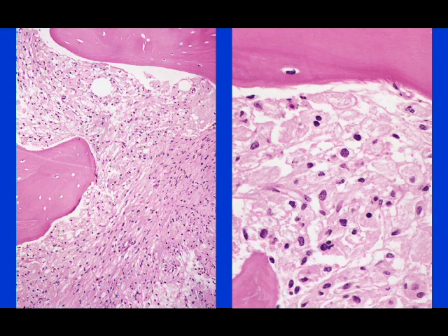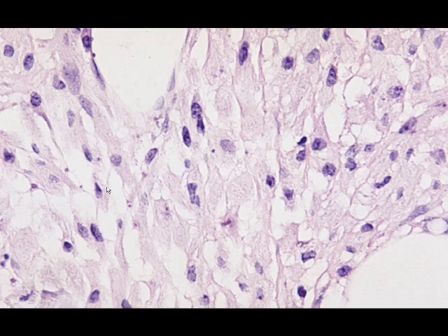But at age 35, the patient was worked up, and what we see here is a lesion in the bone marrow in which we have these histiocytes, but some of them seem kind of degenerative. Others seem pretty good, actually, for Gaucher cells. And then we have these kind of spindly cells over in the left, which are part of the Gaucher infiltrate.